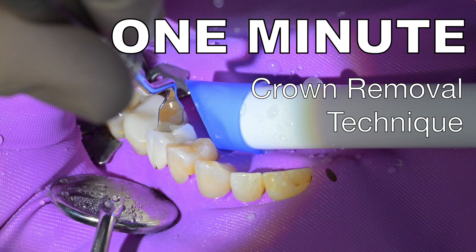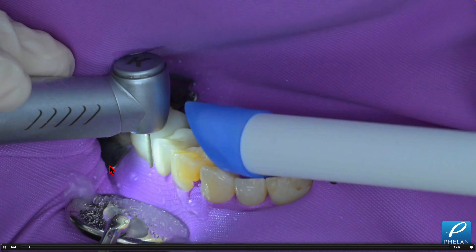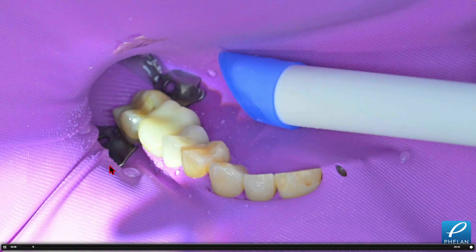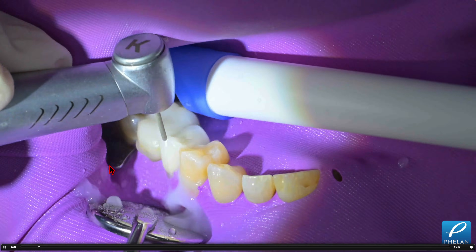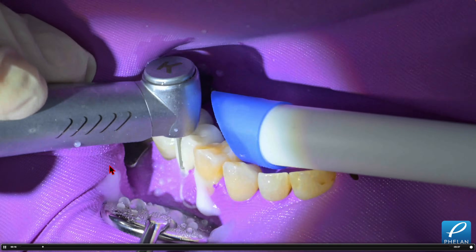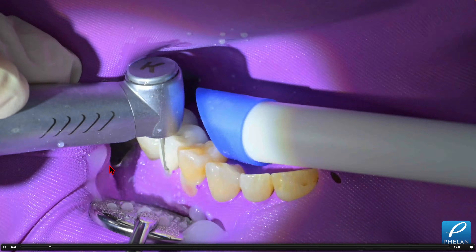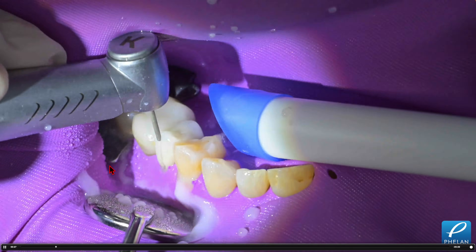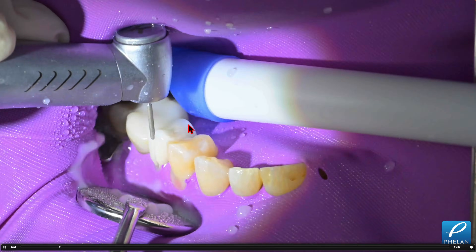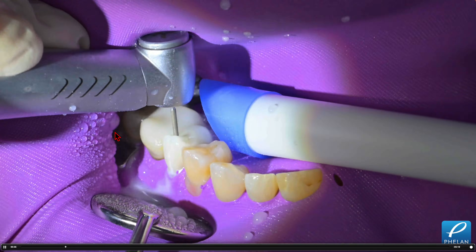This is shot this week with my overhead boom camera. I'm going to split the crown with a KS0 diamond. The narrower diamond is better because we need to cut a smaller, narrower slot for the instrument to go in. After testing a number of different diamonds, this is the ideal diameter. The majority of the time spent doing this procedure is really just cutting the crown in half.